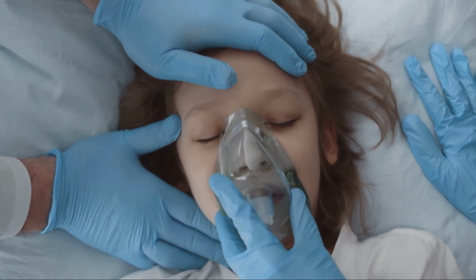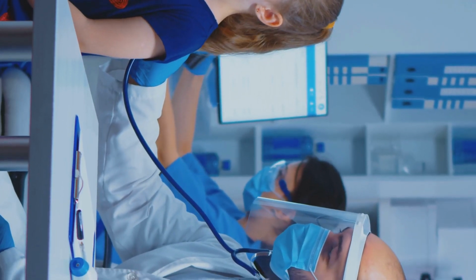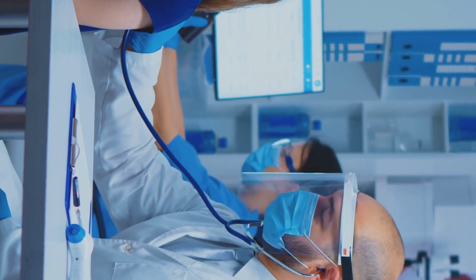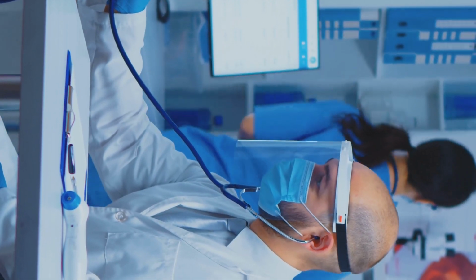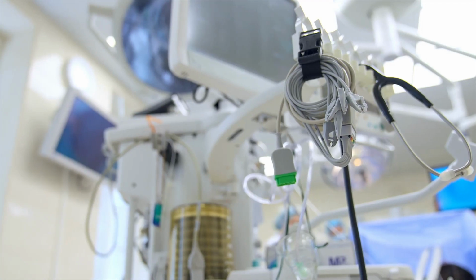Deep extubation refers to the removal of an endotracheal tube while a patient is still under the influence of anesthesia. It's a technique that's particularly useful in specific cases such as pediatric anesthesia or when managing the airway is challenging.